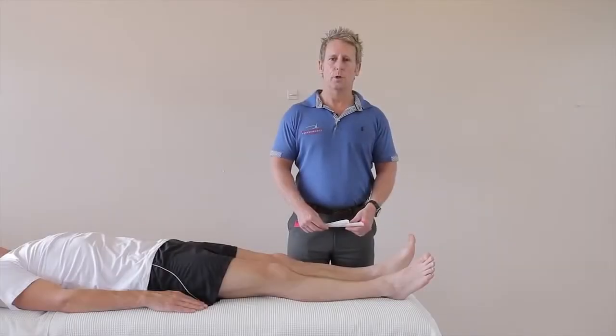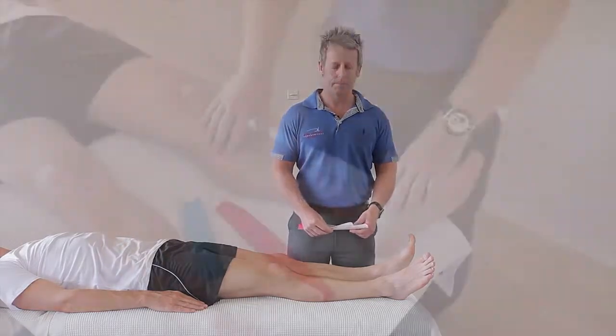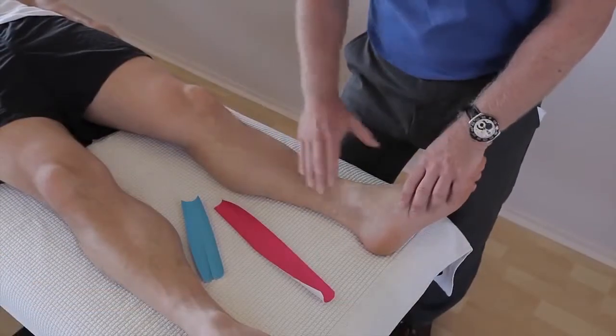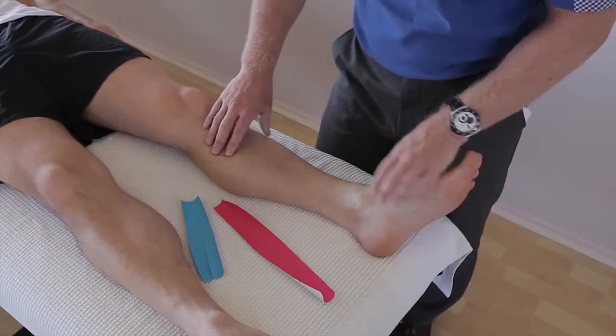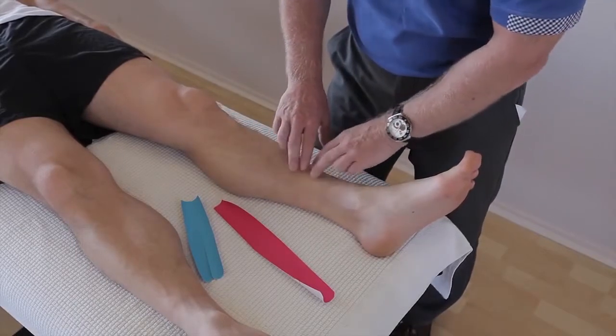In this video, we're looking at taping for medial tibial stress syndrome, commonly known as shin splints. It's actually taping for tibialis posterior pain. When patients present with pain around the medial side of the shin, it could be coming from a multitude of areas. One of them is actually coming from the actual medial part of the bone.